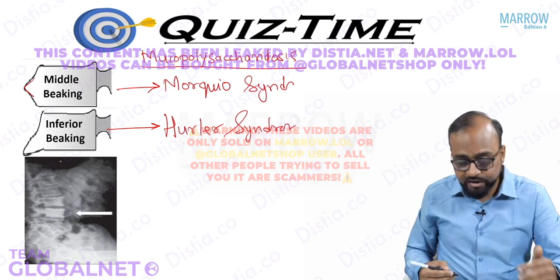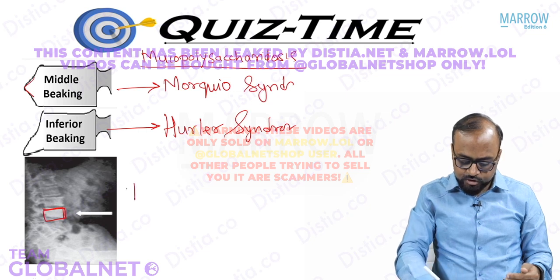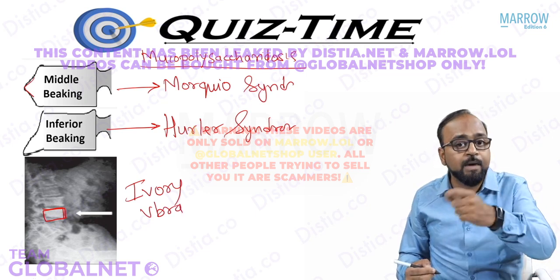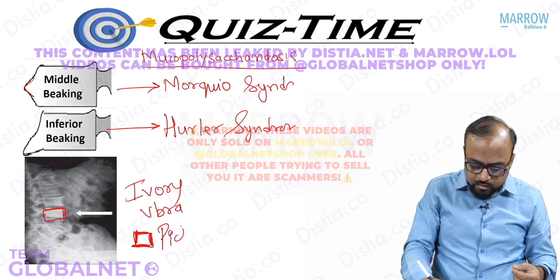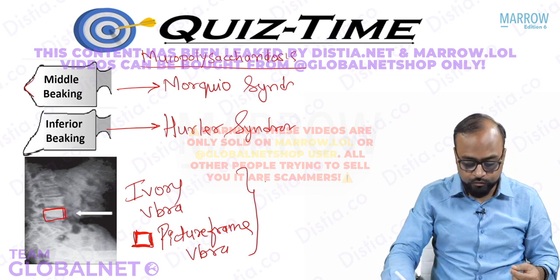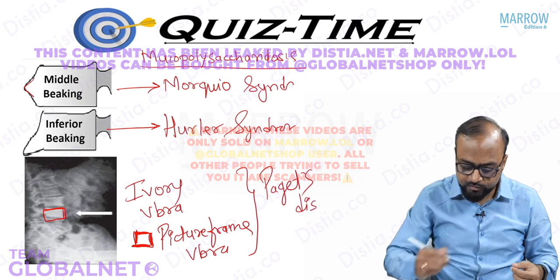Now here what you see in the radiograph is that one particular vertebra is appearing excessively white. So this is called ivory vertebra. So the entire vertebra becomes white. Sometimes only the margins of the vertebra become white or dense, like this. So it looks like a picture frame. So this is called a picture frame vertebra. So ivory vertebra or picture frame vertebra, these are both features of Paget's disease.